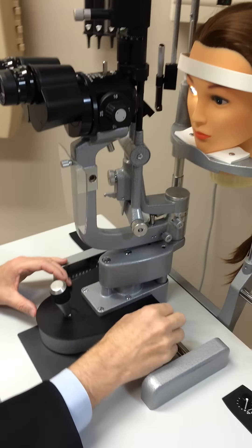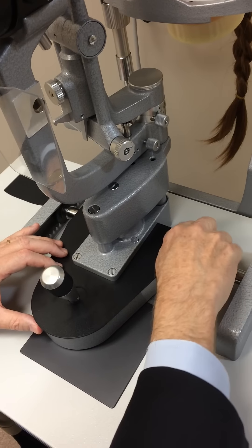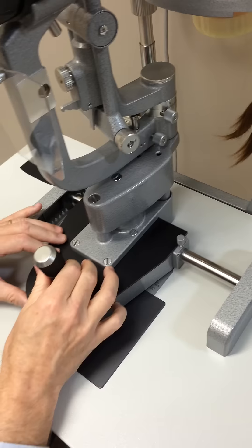In order to use the lamp, you need to unlock this button because this locks the base from moving. This now allows the base to move.